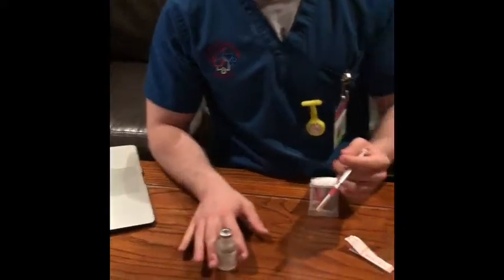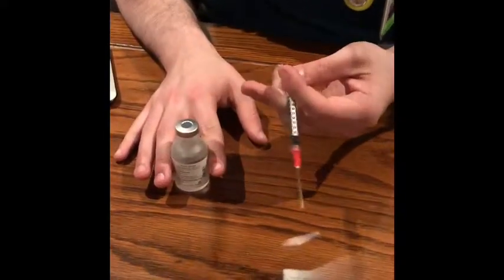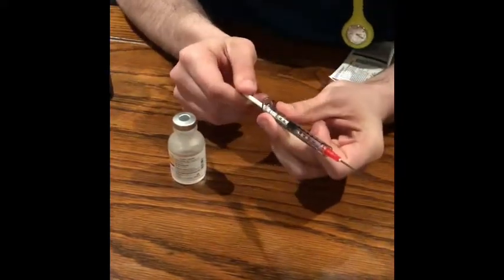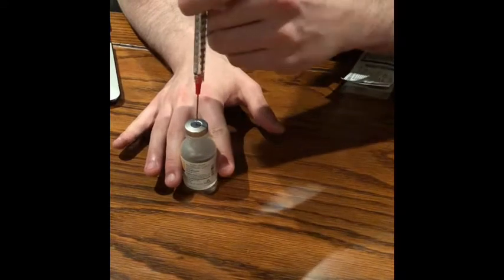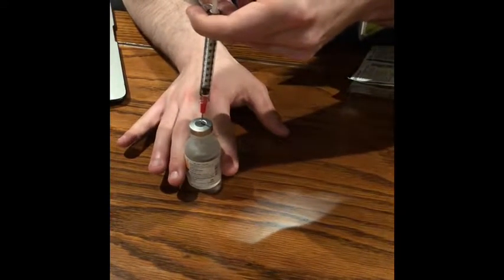And then with our medication, we will draw back the required amount. So for the heparin, with its concentration, we would like 1 milliliter volume to administer the 5,000 unit dose. So we inject air into the top here, and then release the air.